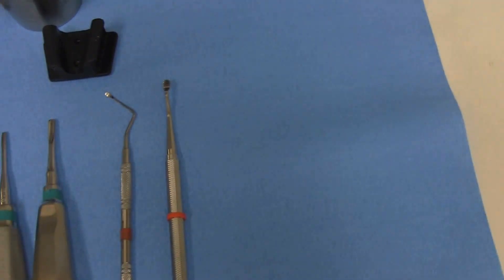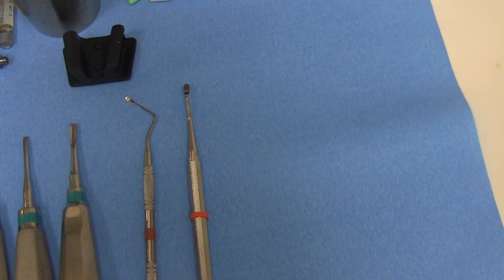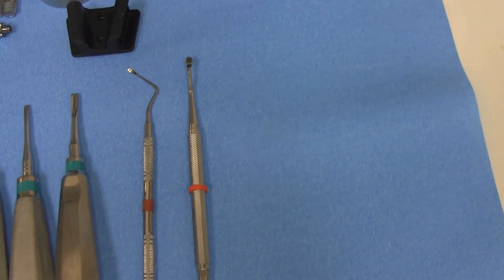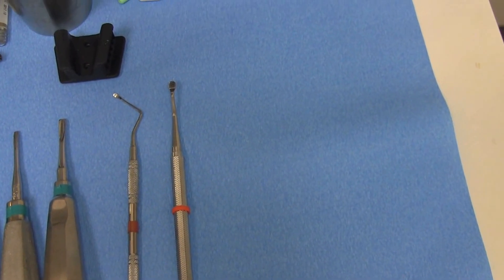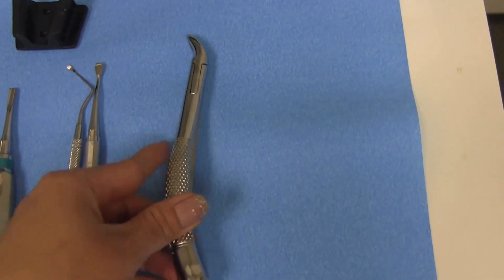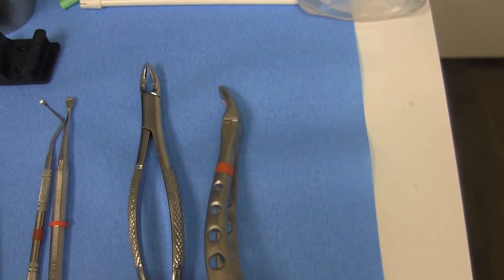So you have your bone file. And then you want to put out your forceps. So we have two different types of forceps that we have in the office. We have this one, and then we have ones with holes in them.